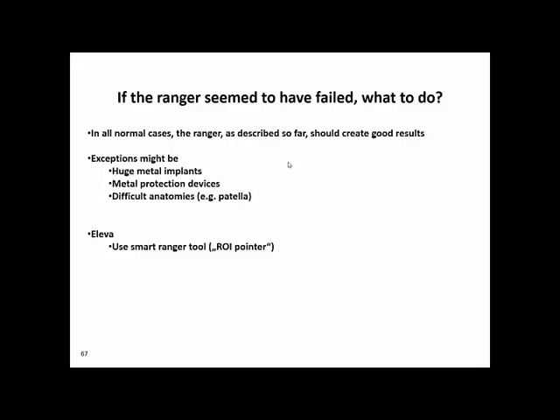This includes some dangers, because people will be doing this without talking to a radiologist, according to their own taste in the X-ray room, on a monitor that is not diagnostical, and with an ambient light that is completely different from the radiologist reading room. So it's a very bad idea to correct image problems manually in the routine work by window and level. That is the reason why we introduced this special tool.